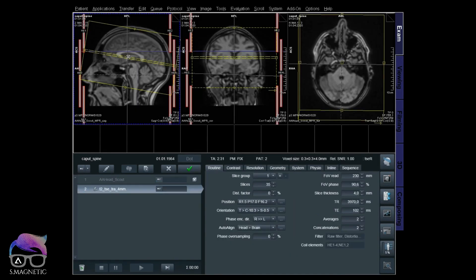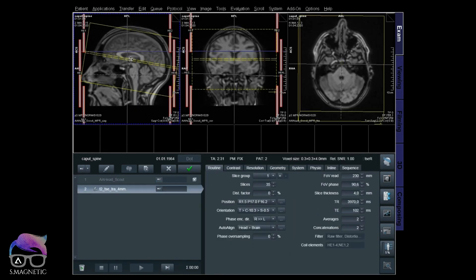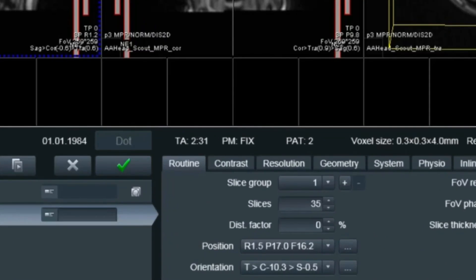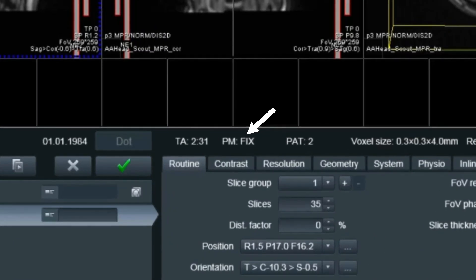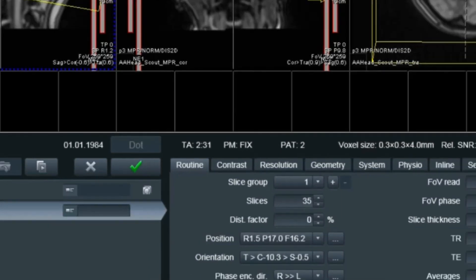I'm positioning a T2 weighted sequence just to demonstrate. As you can see here, the position mode is set to fix. I'll show you why I'm using fix for the head and not ISO and not reference.